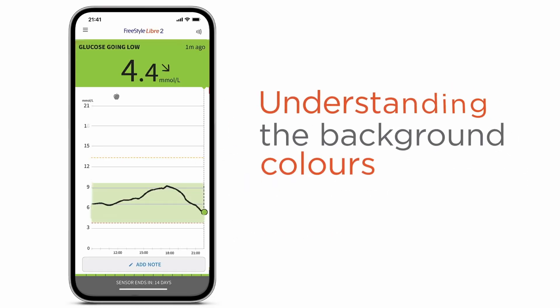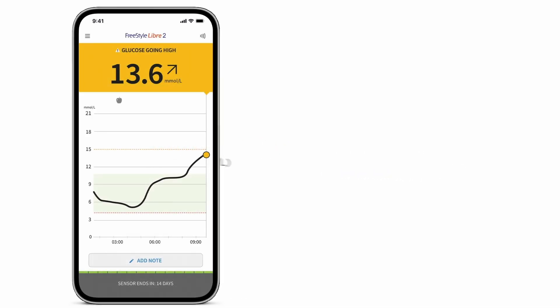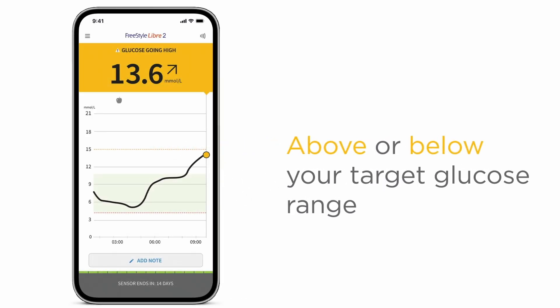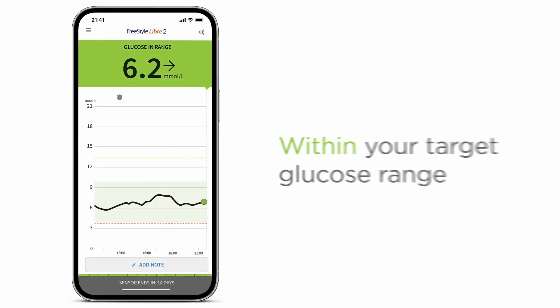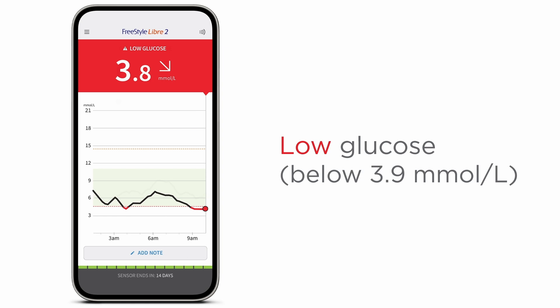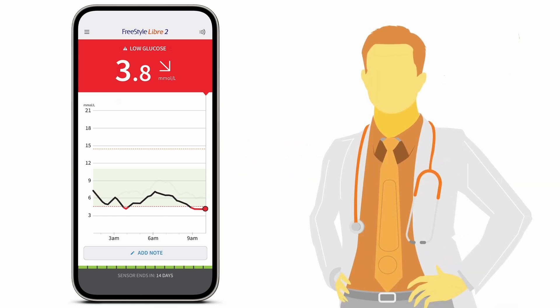You'll also notice there are different background colors when using the app on your phone. Your current glucose value determines the background color. Yellow means you're above or below your target range. Green means you're within your target range. And red means your glucose is low. You can work with your healthcare professional to set your personalized target range.